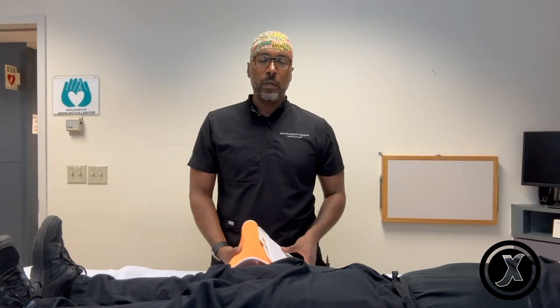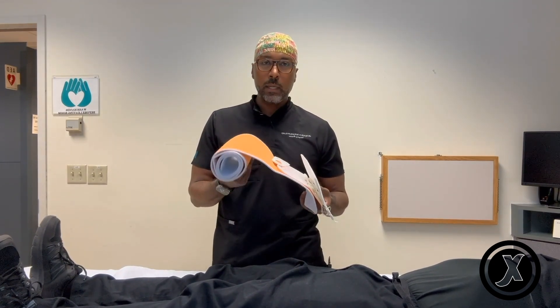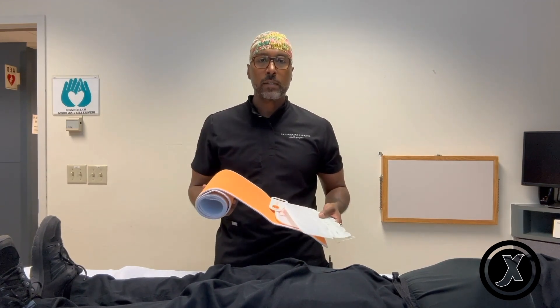Now I'm going to show you how to place it on a real demonstration. First, I'm going to demonstrate how to place a commercial pelvic binder — the one we use commonly here is called the teapot. But also in the second video, I'm going to show you how to place a pelvic binder using just a bed sheet.